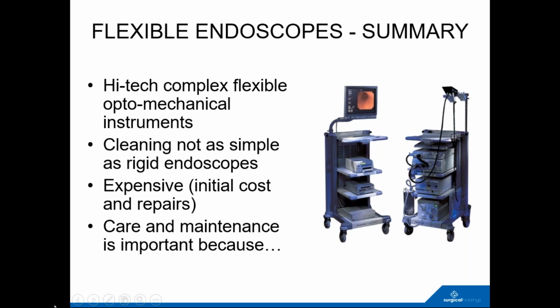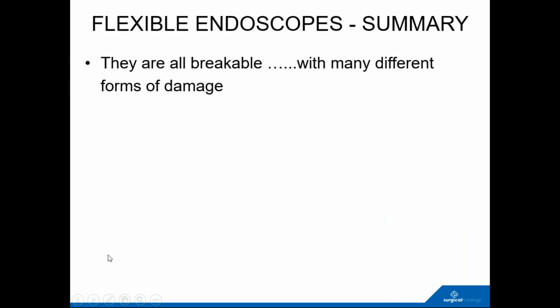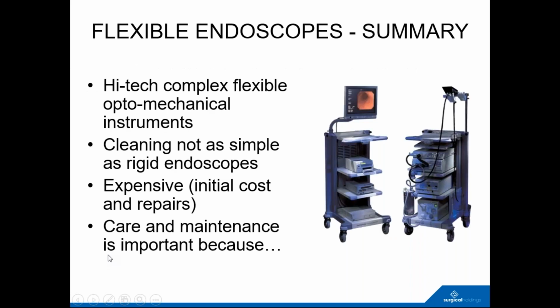In my former life, I had many situations where it was simply on these monitors here, there's line inputs, and the cleaner had changed the line input from one to another. And as a result, it was a blank screen, and I was getting an emergency message to come in to say help. So a variety, difficult to actually say.